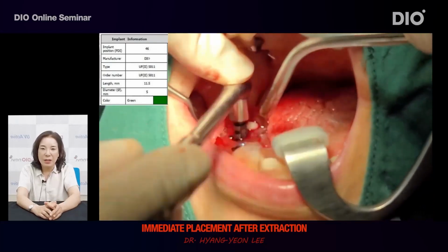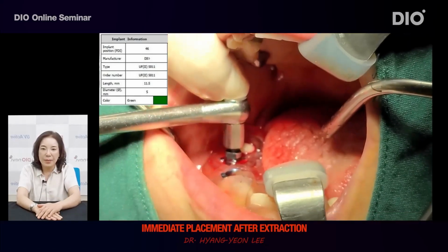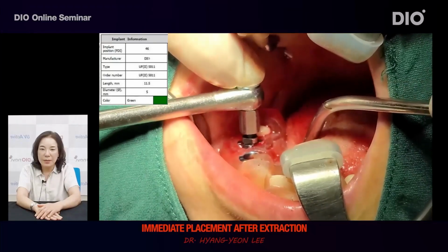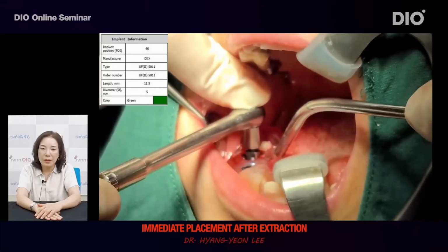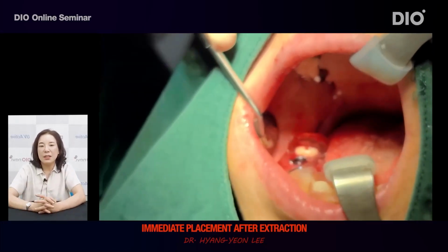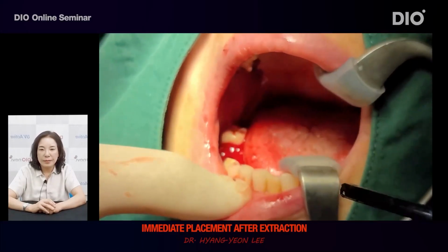Since the wrench is caught by the guide because it is too short, the implant is being placed by inserting a stent. Since there is an offset, the implant needs to be placed to the top portion of the offset. Implant is placed accurately by considering the offset. After placing, take the sleeve out. Being able to take it out this well implies that it had been placed accurately in the proper direction. If the direction is deviated, there is a tendency of having difficulty in taking the connector out. However, there is no major difference.